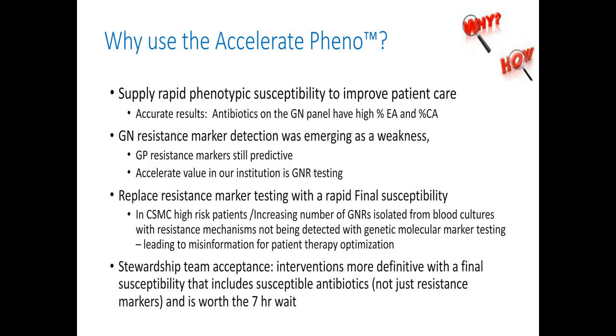Thank you. Our next question is, what have you observed about clinicians' willingness to adjust therapy based on phenotypic MICs as compared to resistance marker test results?